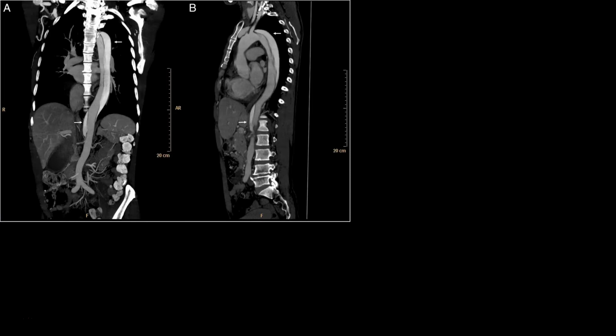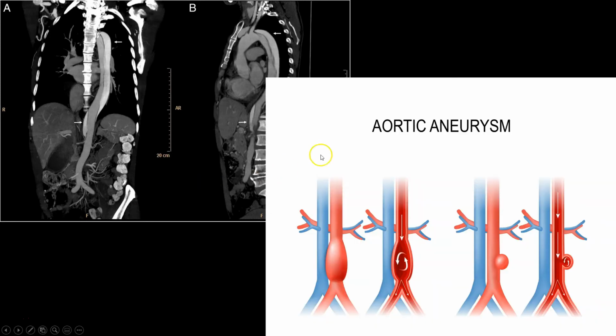The diagnosis that it is far more helpful for is actually for AAA. So abdominal aortic aneurysms come in two major flavors: fusiform and saccular. Fusiform aneurysms are these nice symmetrical, bilaterally visible dilations in both walls, and it's a symmetric dilation. And the reason that's important is because, as you'll see, sometimes it's hard to sort of track every small centimeter of the aorta and to catch both walls all the time. But if this is symmetrical and it's a relatively large area that tends to get a fusiform aneurysm, you'll find it more often than you would find a small saccular aneurysm that just comes off of the one wall. So it's much more likely that you'd miss this.